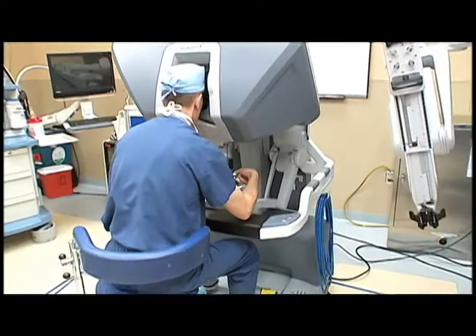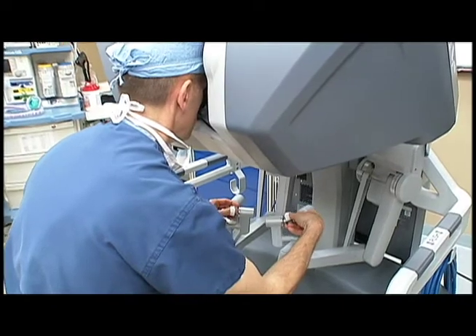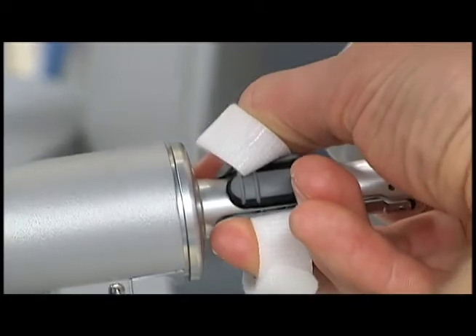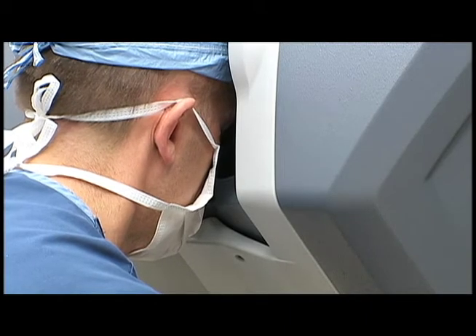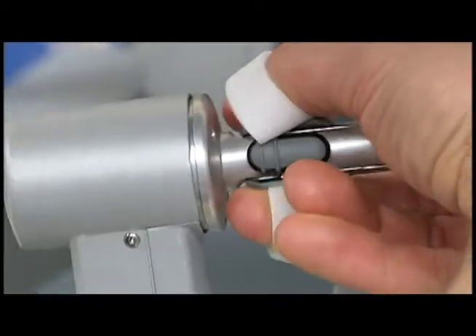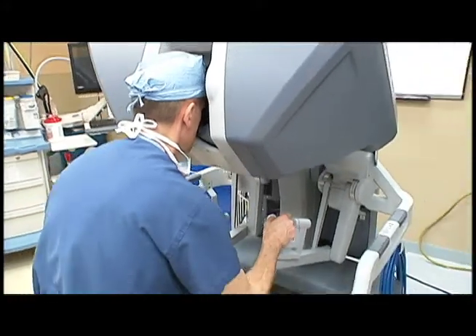It eliminates human tremor through the software. The robotic surgery, some of the things it offers, because the robot controls some of the movement of the instruments, it actually results in even less pain than just conventional laparoscopic surgery. And everything is magnified to a great extent, and it just allows for very precise control of surgical instruments and great vision of them. And it can be used for so many different surgeries in the head and neck region, and especially in the abdomen.